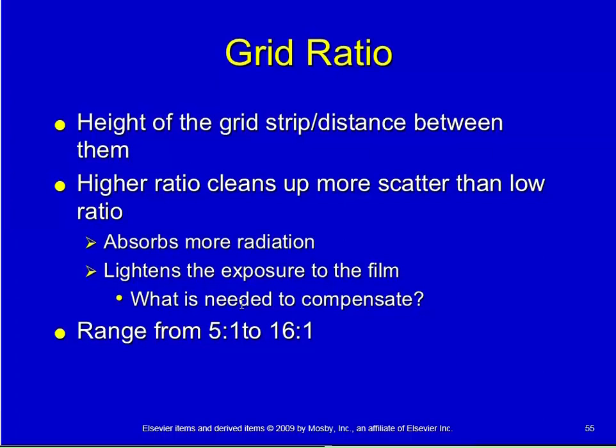You could tell not by the image itself, but by your index number. You did not use a grid for whatever reason. And the doctor said, well, I want to see this again, but it's an ugly image.